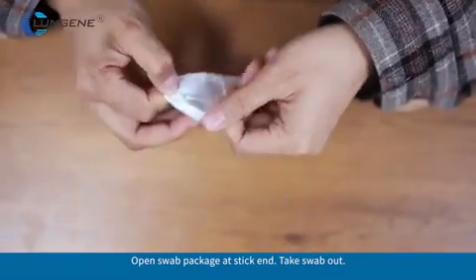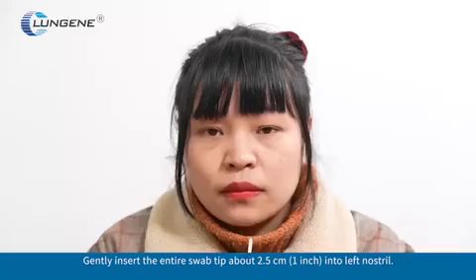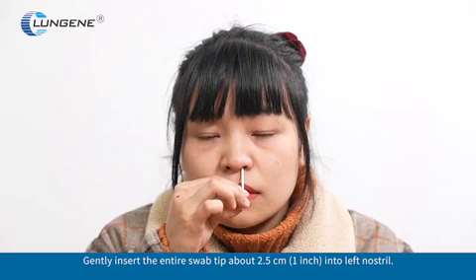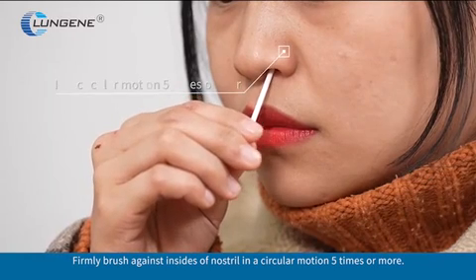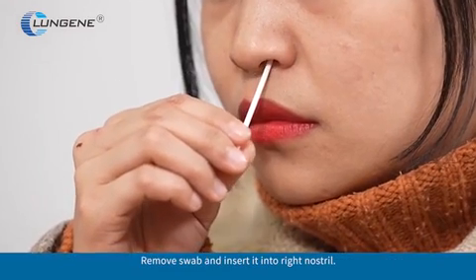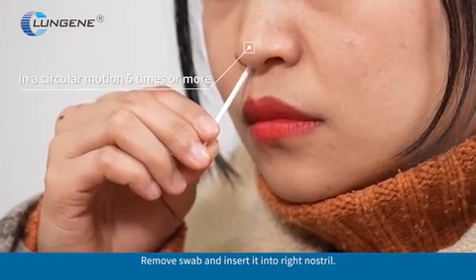Open the swab package at the thick end and take the swab out. Gently insert the entire swab tip about 2.5 cm (1 inch) into the left nostril. Firmly brush against the inside of the nostril in a circular motion 5 times or more. Remove the swab and insert it into the right nostril.